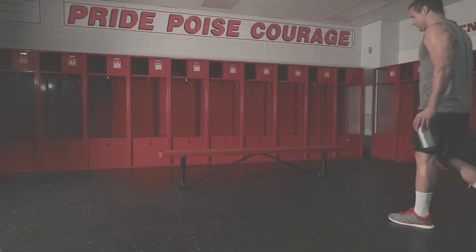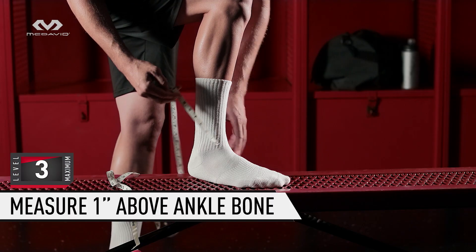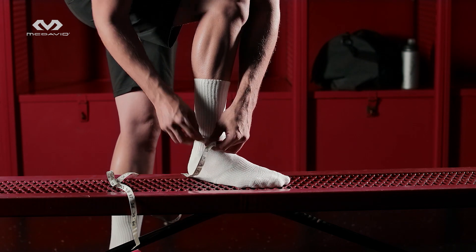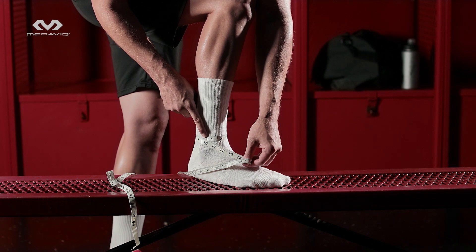No matter how well engineered our products are, if the size is wrong, the support performance is wrong. Stand and measure your ankle circumference one inch above the center of your ankle bone — that's the prominent bump right here. Compare your measurement with our size charts online or on our packaging.